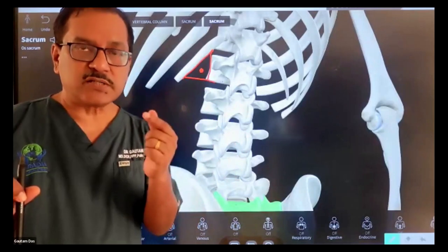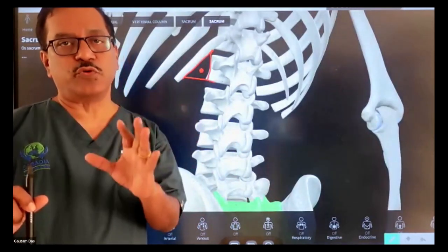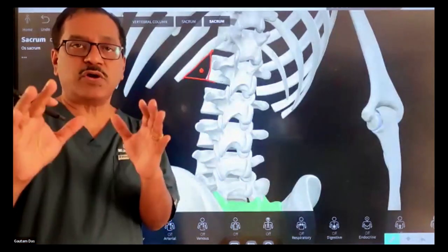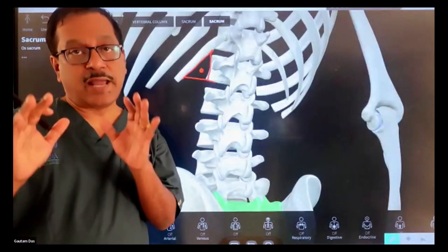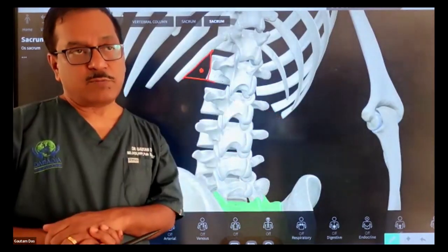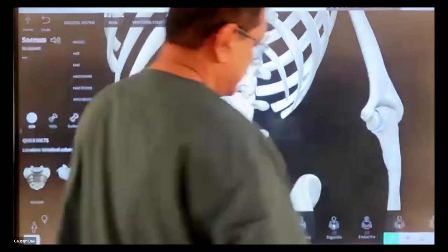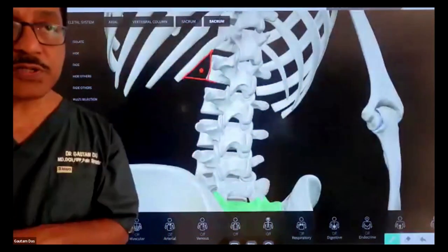Entering the aorta, you find your celiac trunk, and around the celiac trunk is the celiac plexus, and you go for the procedure. So I'll be sharing one live case video. Today also I'll be showing you the procedure in the Mannequin, and you'll be able to understand how to go ahead with that. So that's up to this much for the 3D anatomy.